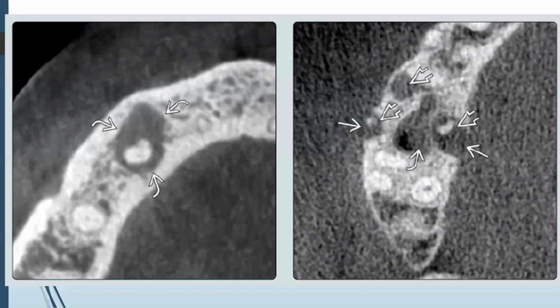Okay, so it's actually not necessary, but still, if you have doubts like which of the root canals or the root apices are involved, or if it's involving the maxillary molars or the premolars, then it becomes an utmost necessity. But actually, we don't take CBCTs for a normal radicular cyst, because the conventional radiograph gives a better definition than the CBCTs. But in exceptional cases, like if you're finding out who is the culprit, then it becomes a necessity.